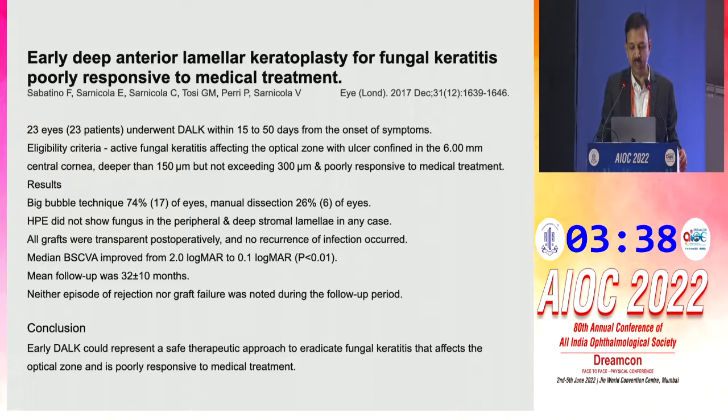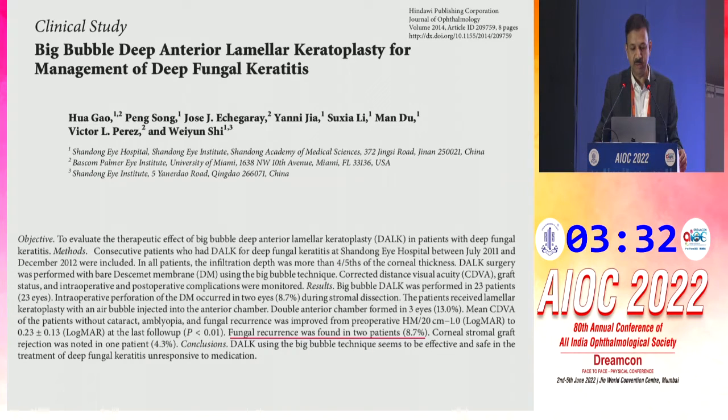And they were able to successfully clear the infection using the DALK procedure. Another paper from China where they again used the big bubble DALK surgery. The recurrence rate was only about 9% in their series.